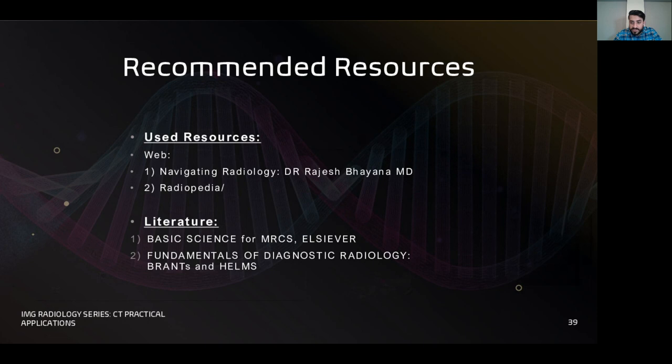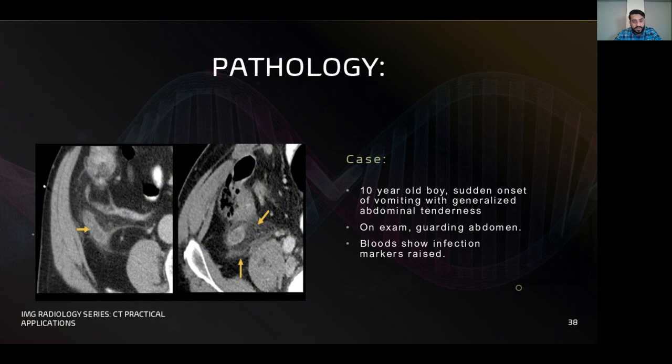Where can we see infection after the ruptured appendix? Edgar, I'm assuming you are asking where we can see the infection. With a ruptured appendix, it would usually present as massively dilated, and also with infective changes around it in this particular region. So yes, you're right. There will be a lot of infective changes around this particular region, and it will be enlarged as well. The usual appendix, it depends on the age, of course, and the body type, but essentially it ranges from about 2 to 8 centimeters.